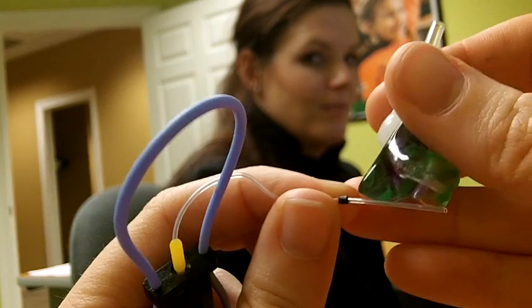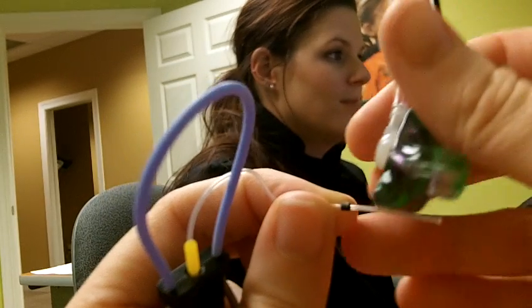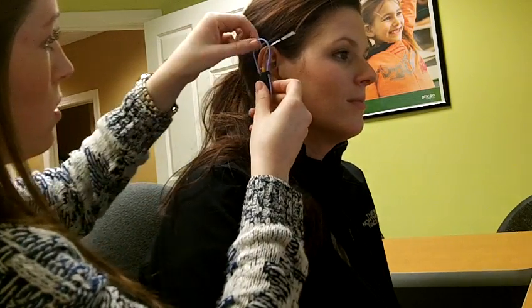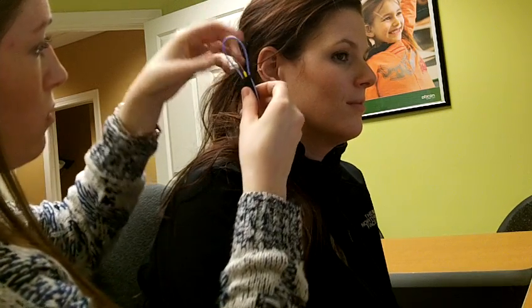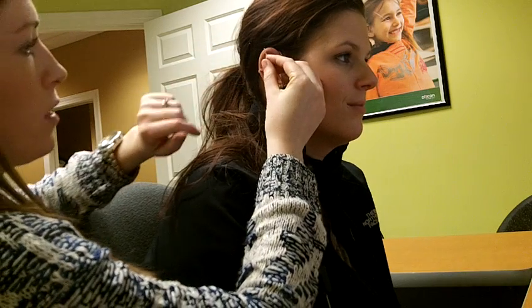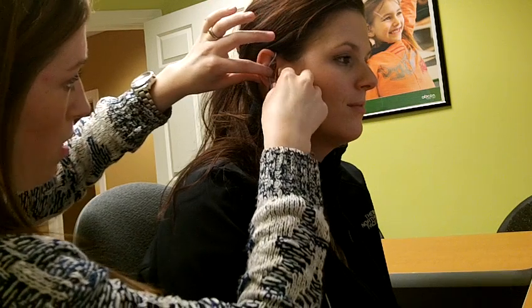So in order to do that, you're going to do this, and then you're going to move this marker so that it's right on the edge of the ear mold, like so. So it's just sticking out just a little bit further. So then the setup is like this. You hang this blue part over the ear. This was made for a kid, so we're going to adjust it. Like so. And then you're going to take the probe. You're going to stick it underneath the front blue string.